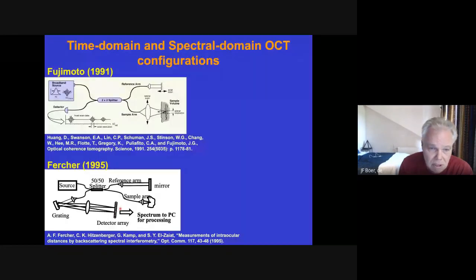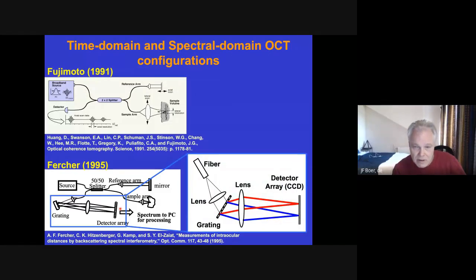So let's take a look at the spectrometer. It means we'll have the fiber from the detection arm. Using a lens, we can create a collimated beam. We use a transmission grating, which breaks up the light in different directions. So every color is sent into a different direction. And then we use a lens to image those different directions to different locations on a CCD camera.